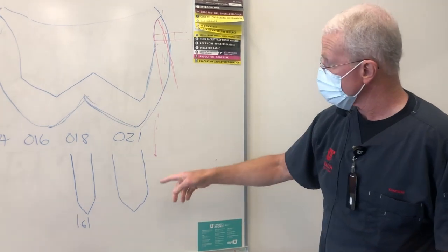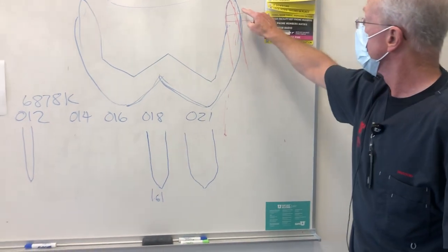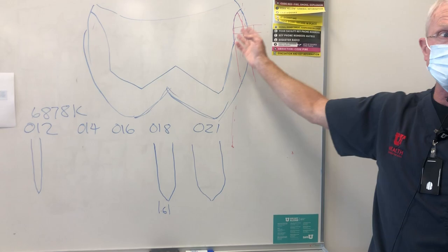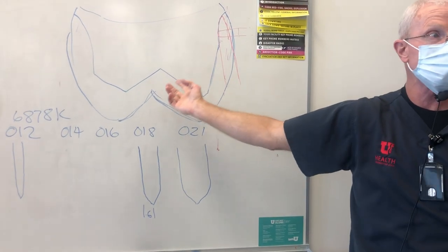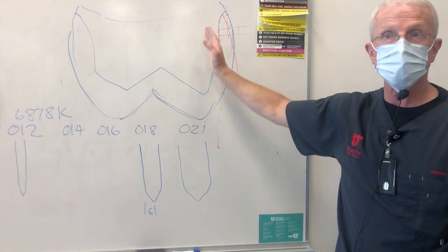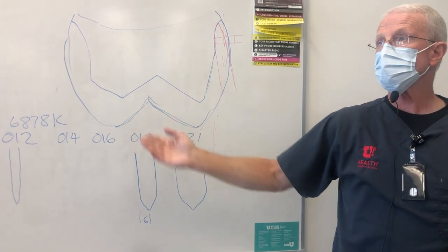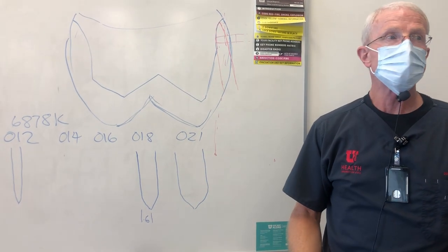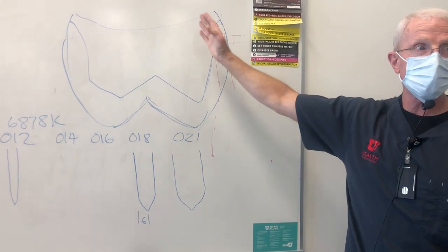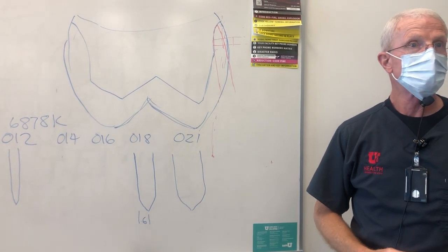So again, as I mentioned before, you could do a chamfer preparation with this 012, and you could take it as deep as you'd go for a PFM, which is 1.2 to 1.7. But you'd be walking that little teeny burr all the way up that margin. It would take you a long time and it would be very difficult. So you want to use the largest burr that you can use, and you will be taking it up the axial wall. You won't be able to keep it right down at the margin to do your preparation.